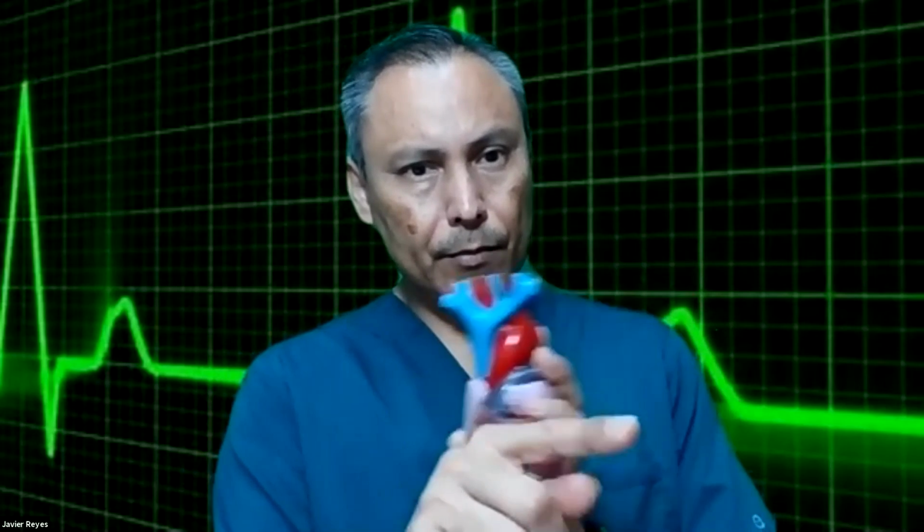So where are you going to see the change in the EKG? You have your SA node fire, boom, P wave, look, P wave. And then this is your Q right here, R, right? You have your P wave. The PR interval is what we're going to be looking at.